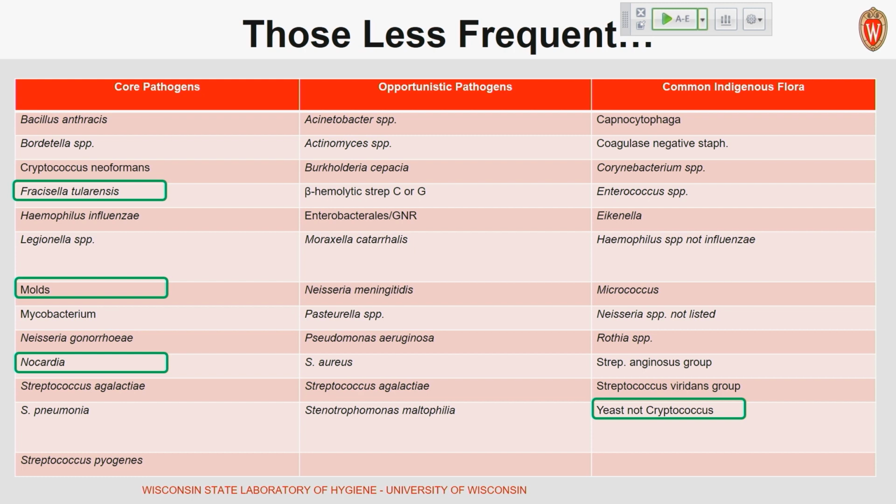All right. I think we got about 10 minutes or so, so we'll try and do this in a timely manner. There's a number of different core pathogens, opportunistics, and really what falls into the common indigenous flora. And there's workup criteria, the whole significant predominance, those things that go into it. So just kind of breaking them down into the tables for depiction here, and then just highlighting those couple that we're going to try and touch on with the time we have remaining.